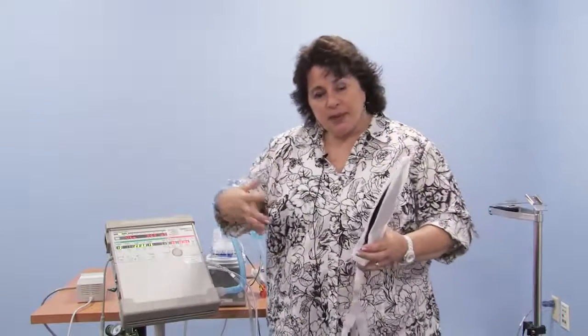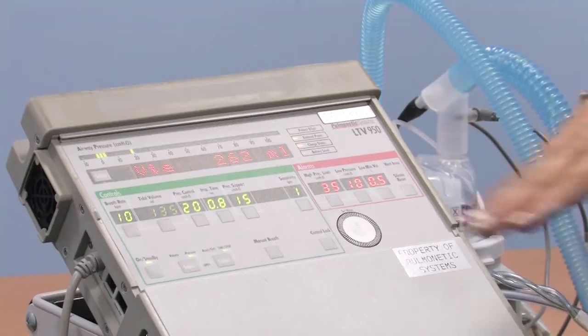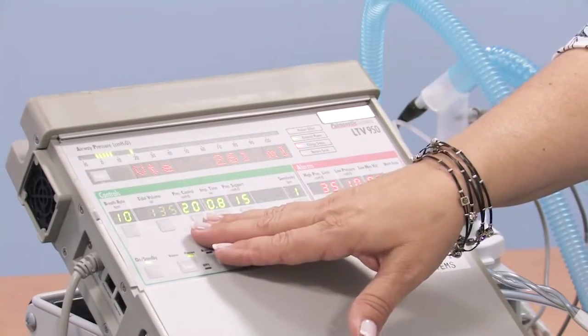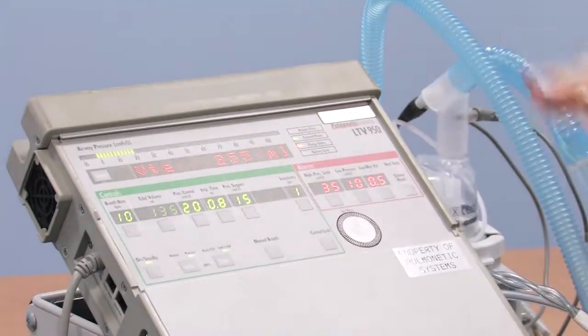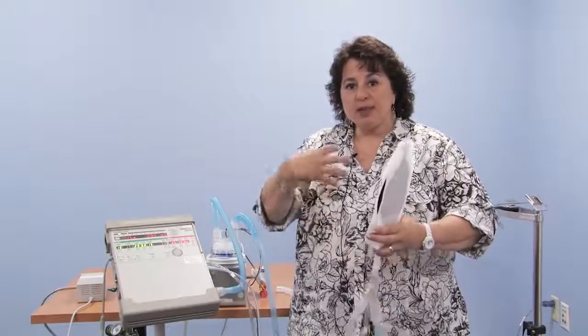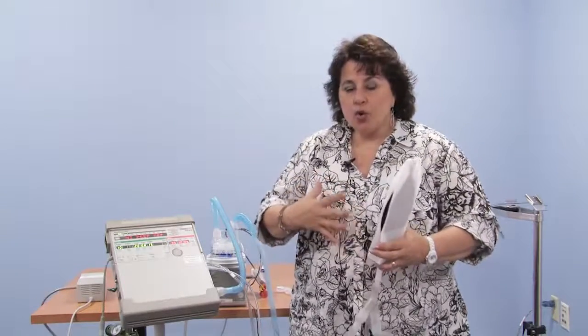The breath size relates to the size of the child's lungs and the ability of the lungs to let air in. So when we've told a machine we want you to inflate to 20 centimeters of water or 15 centimeters of water, up to 20 and down to 5, up to 15 and down to 5, it's your child's ability to let air in that governs the size of the breath. That's very important, because if the tracheostomy tube has some secretions in it, if the lungs have secretions in it, if the child coughs, they will inhibit the ventilator from expanding the lungs the way they would on a normal resting breath. So this is important to remember.